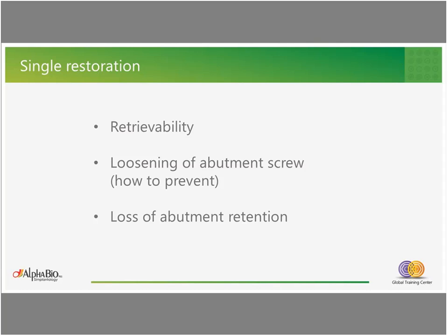And the most important thing is to connect the screw to the abutment and the implant using the recommended insertion torque, which is about 30 Newton centimeters, according to the manufacturer's recommendations. And if we have a loss of abutment retention, we can use the screw-retained restoration in order to have maximum retention, and there's no problem of losing the retention of the crown.